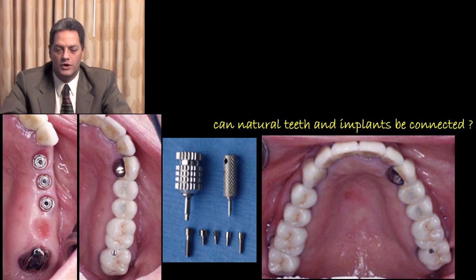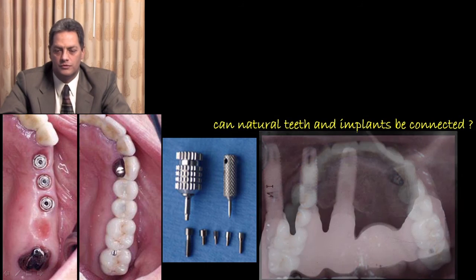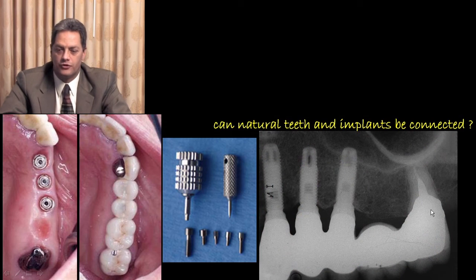So this is the only way to actually prevent intrusion of the natural tooth and telescopic crown away from the prosthesis. And this could be quite helpful as it relates to proprioception. So again, each case must be closely evaluated.